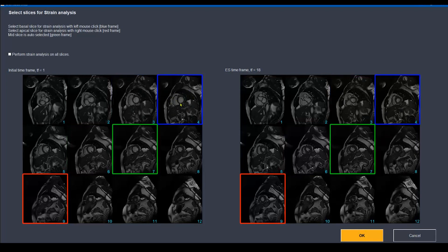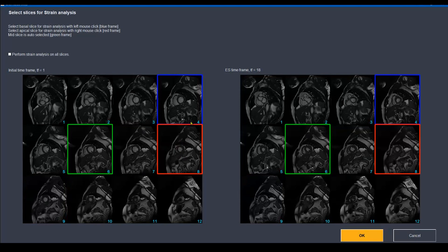We select the basal slice with the left mouse click. The next step is to select the apical slice. The trick behind selecting the apical slice is not to go too far downward, because we don't select the true apex or the apical cap — we should select the apical segments: the four apical segments, which are the apical anterior, apical septal, apical inferior, and apical lateral. So I go one or two slices below the mid ventricular segment and select this slice with the right mouse click. The software automatically puts the mid ventricle somewhere in between. I will press OK to move to the next step.